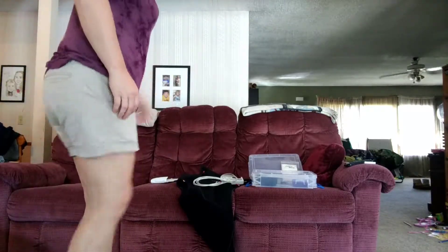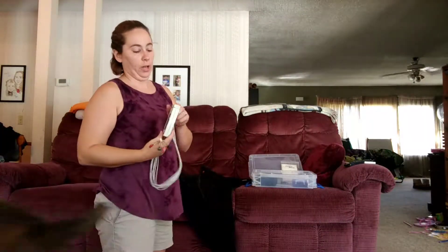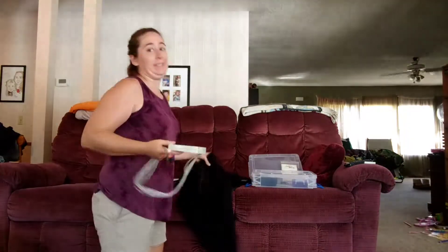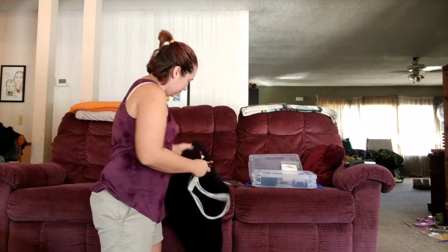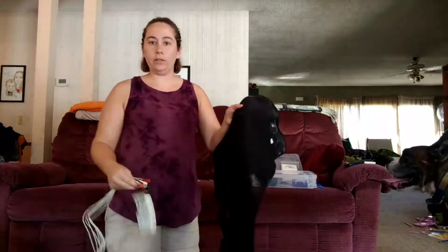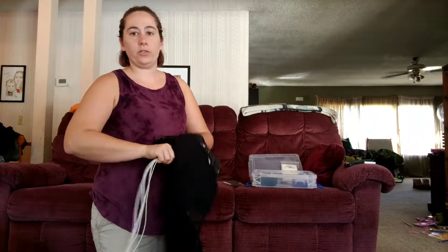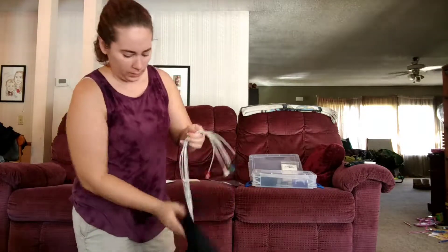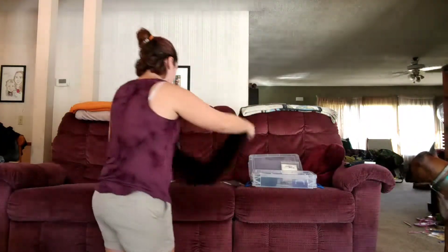I'm going to run you from beginning to end on how to hook up the Holter monitor. My particular monitor is screwed in, so one of the biggest things you want to make sure you do before you hook everything up is there's a hole in the vest — make sure to go ahead and stick the little prongs through already.